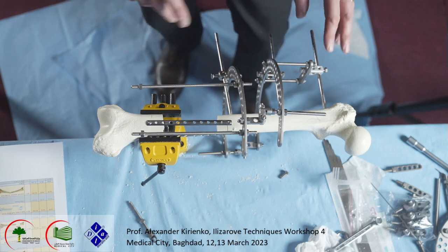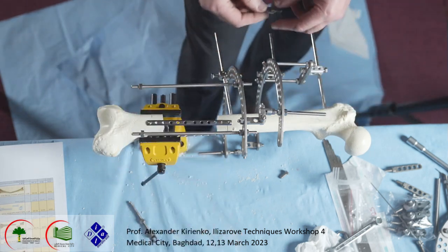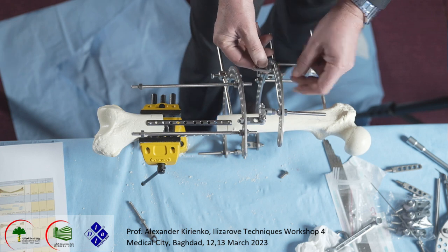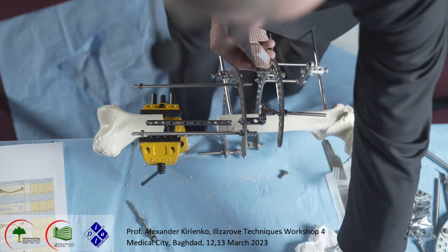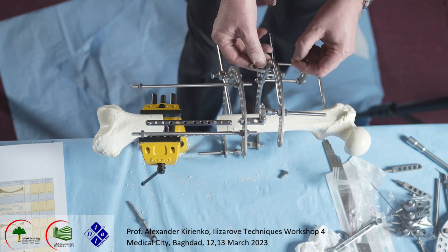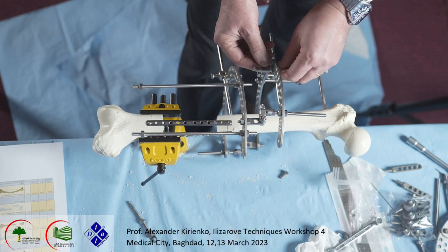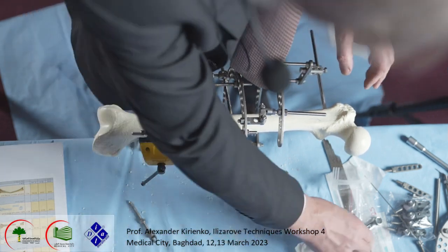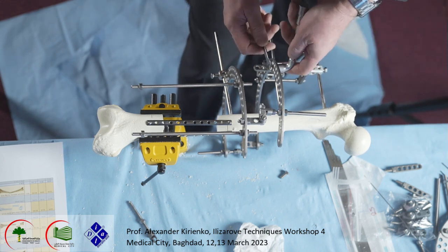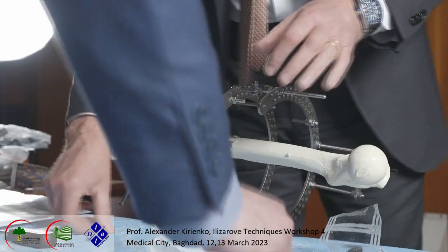What we should do again? Now we build another system for more stability. I put another rod here anteriorly, where I have much more space. I put it like a posterior post here. Okay, I put my rod.